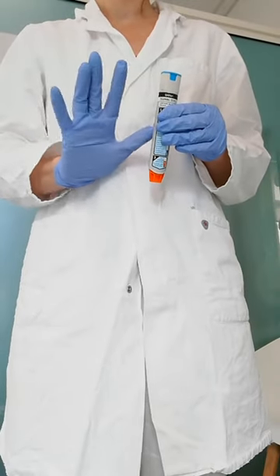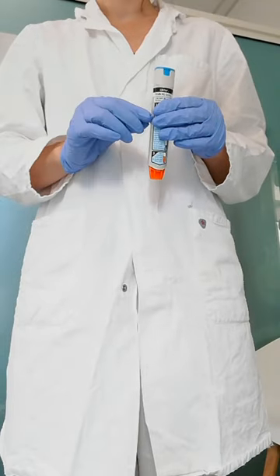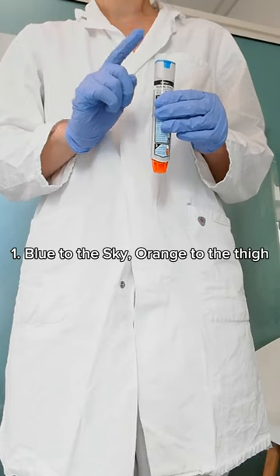EpiPen injection is done in five steps. Step 1: Hold the auto-injector with the orange tip pointing downward — blue to the sky, orange to the thigh.